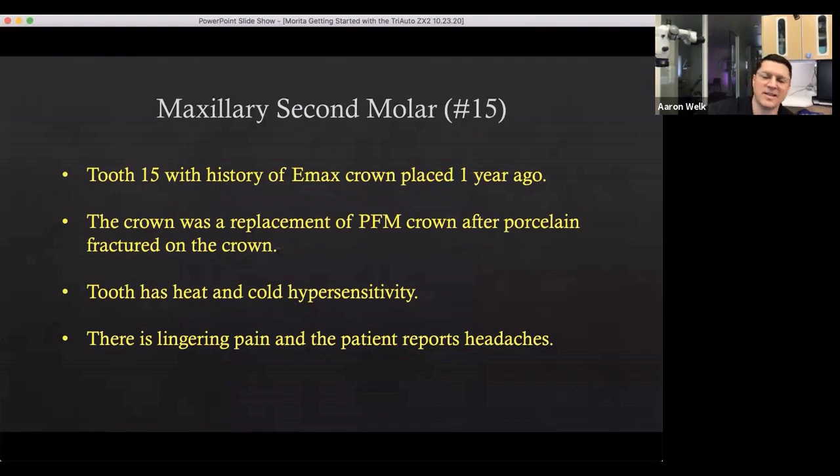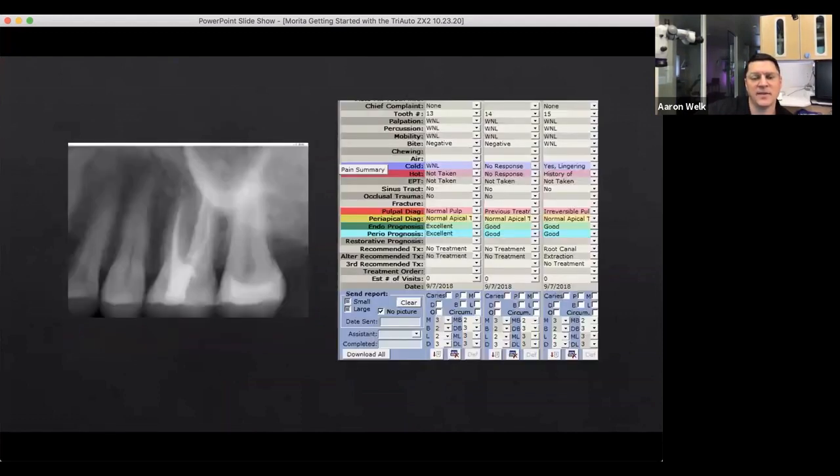This is a straightforward case to give you a sense of putting it all together. This is tooth number 15, which has an emax crown placed a year ago. Prior to treatment, the tooth became cold and hot sensitive and the patient is experiencing lingering pain and headaches. Here's a pre-operative view — we're looking at tooth number 15, the upper left maxillary second molar.